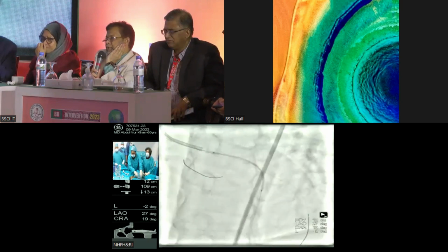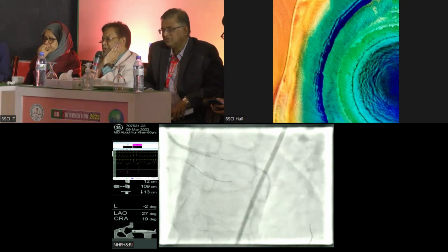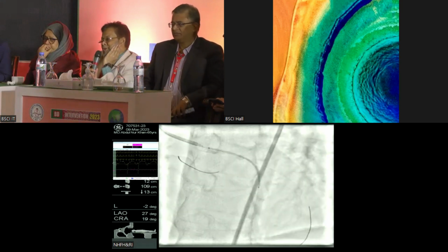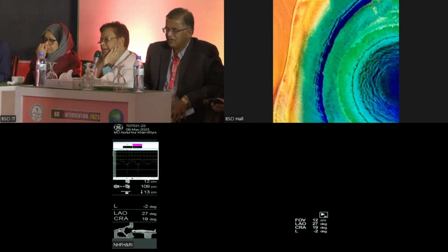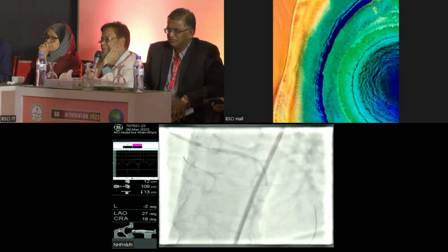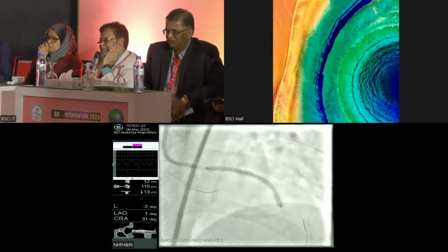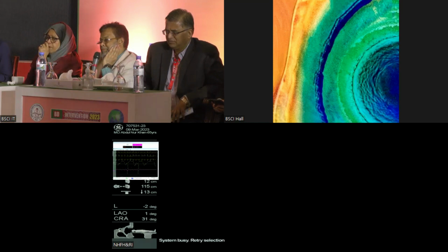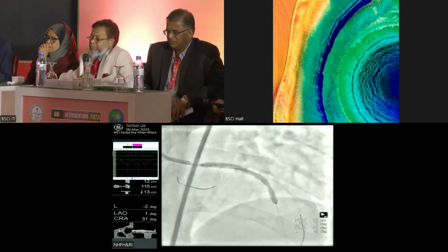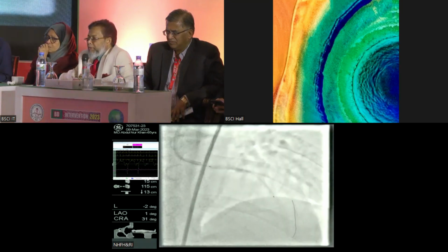Yes. Our younger colleagues, can you tell whether for a lesion involving the ostium, we can routinely use the Judkins left or extra backup? That is definitely possible, and you are using it, but for our younger colleagues, those who will learn, can I add that when the ostium is involved, it is better to use a Judkins catheter? Absolutely. So you see, it's how comfortable you are with what you use. As I said, for us, our default catheter is always the Extra Backup, XB.